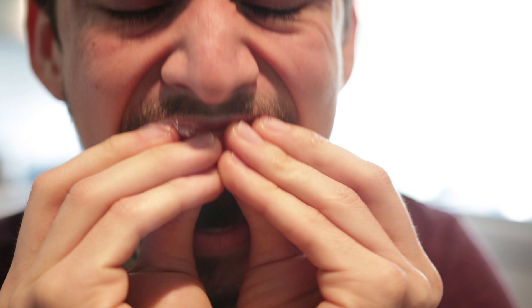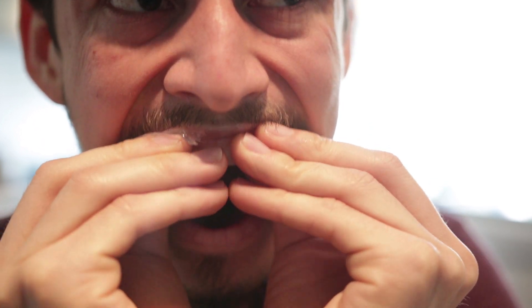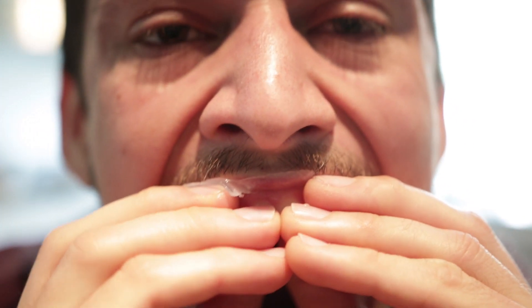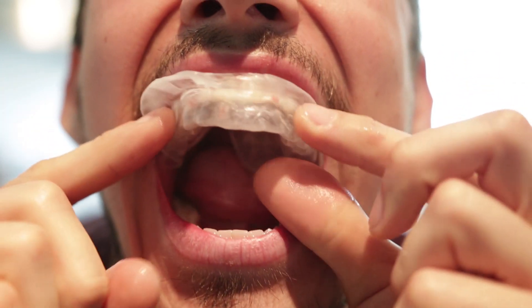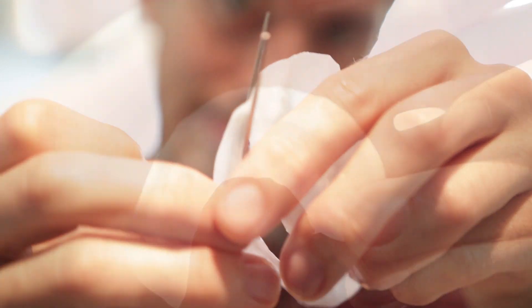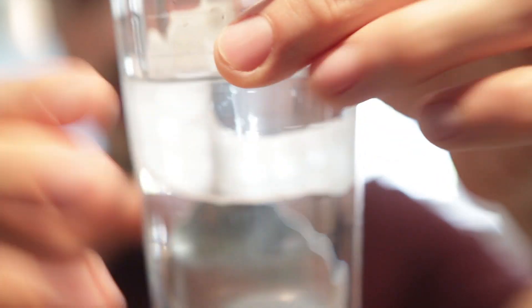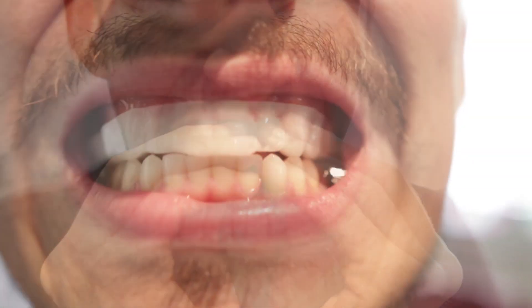I know my face looks like I'm suffering, but it's really just the struggle to keep my mouth so wide open — it's not painful, and it's definitely not too hot. You definitely don't want to heat up the water too much though, as that could be a disaster. Once I had the general shape, I started trimming it more to get it down to size, then repeated the process — putting it back in water, wrapping it over my teeth — until I had a nice perfect fit.